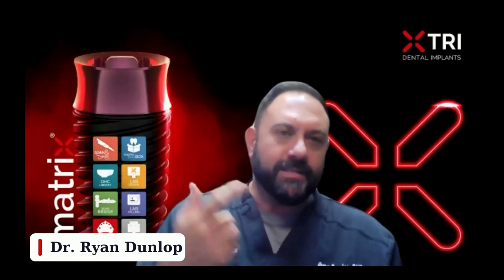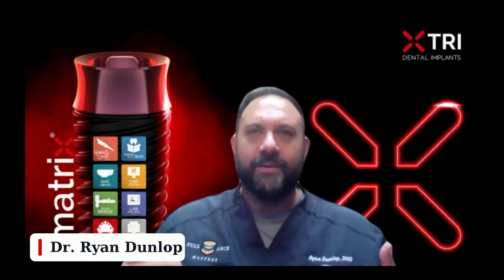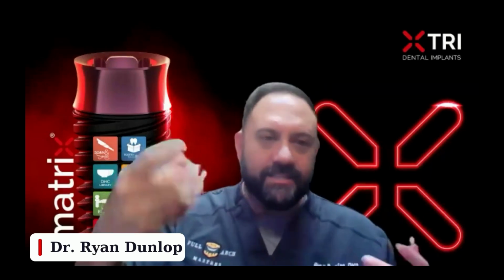And at the beginning, I was annoyed. I was like, come on, guys, this is so dumb. But I don't need MUAs, and I have a 2.9 millimeter bolt screw, and temporaries are stronger. So you give and you get in life. What you give up is the ease of these bridges coming in and off. It is an extra driver, but what you get is so much more in return.